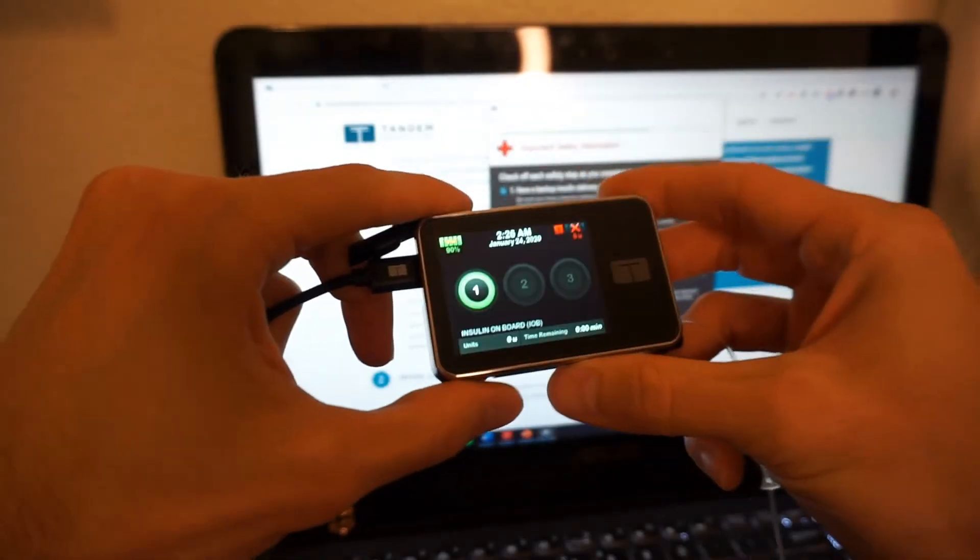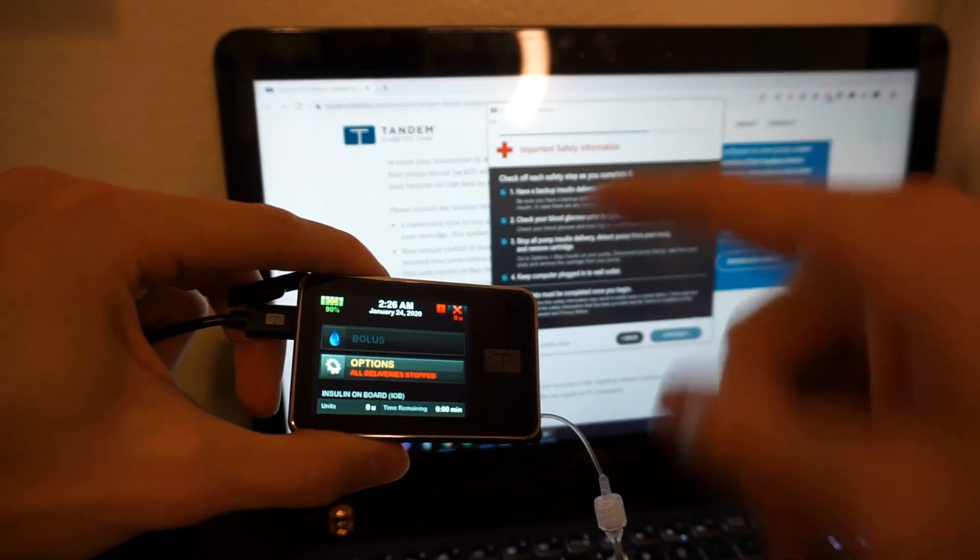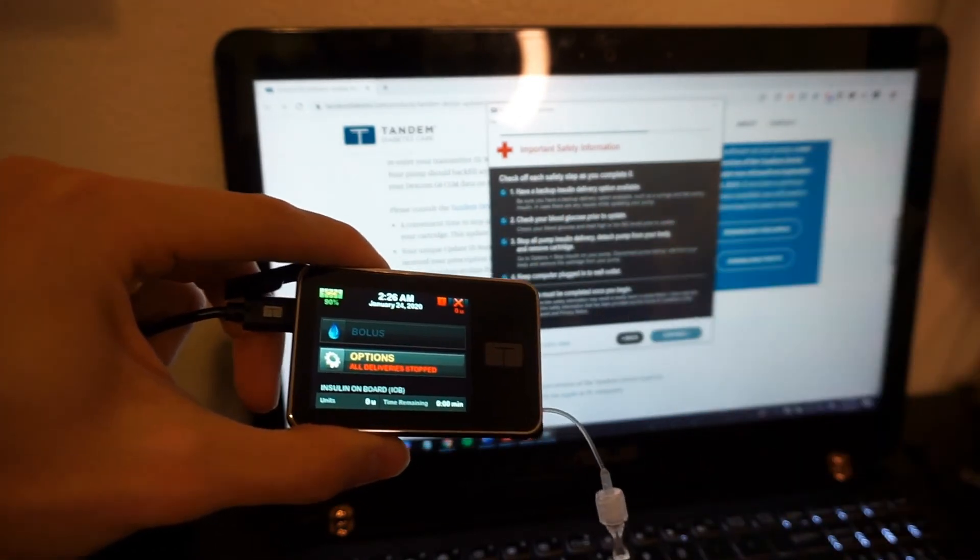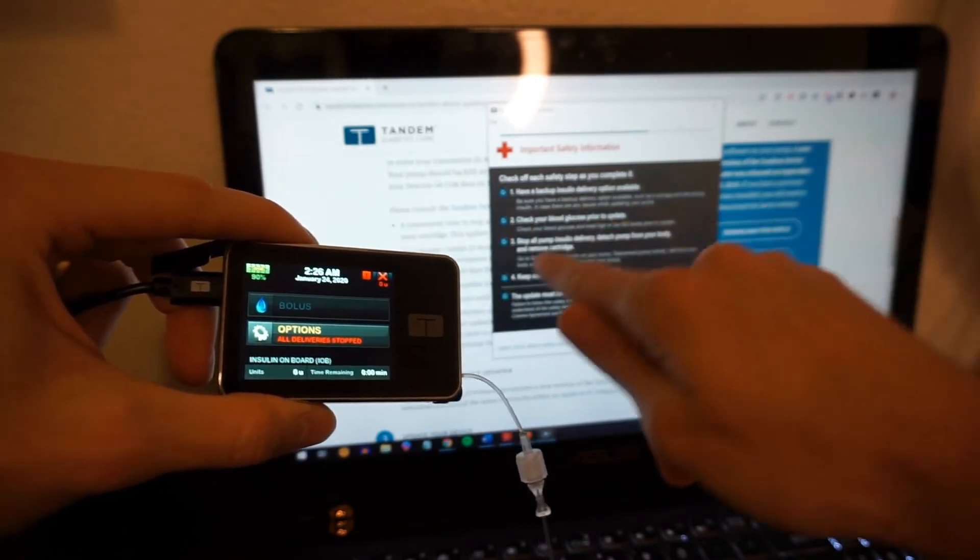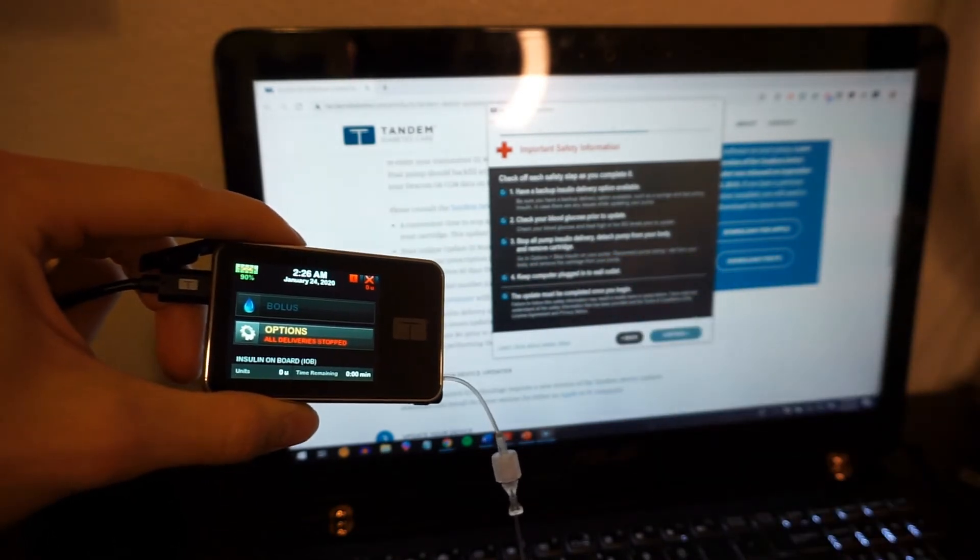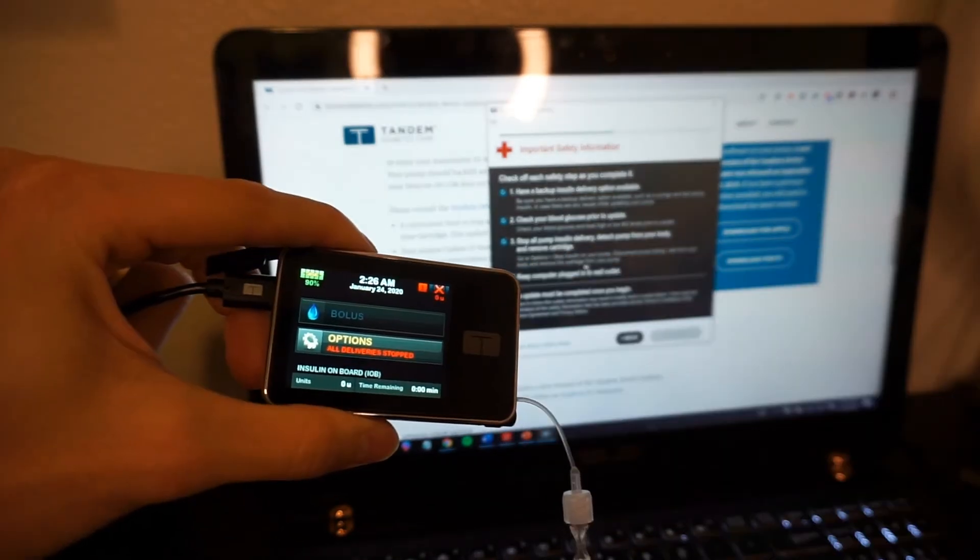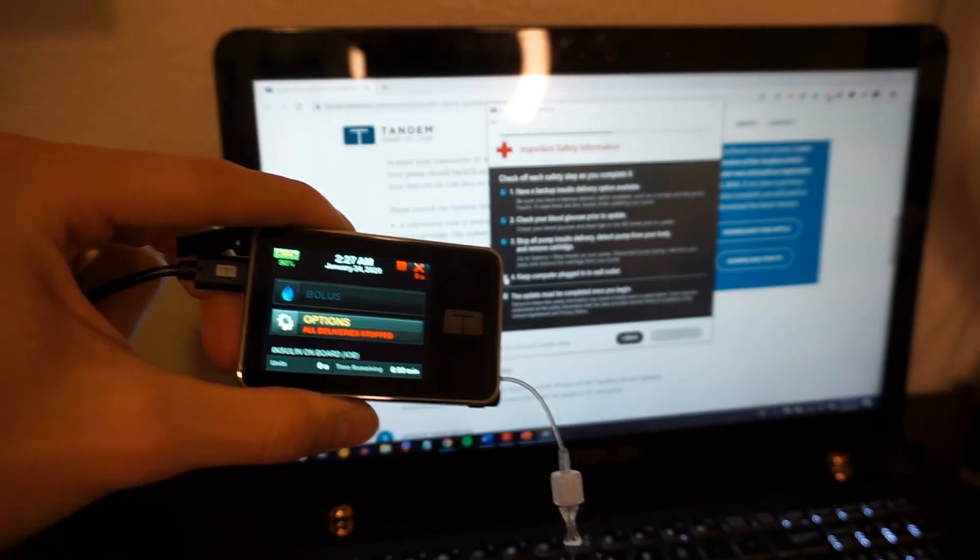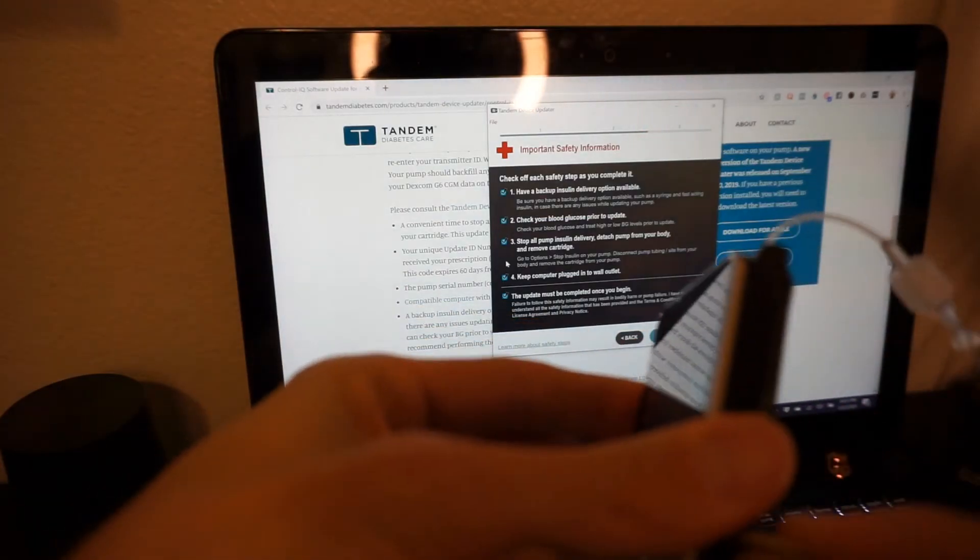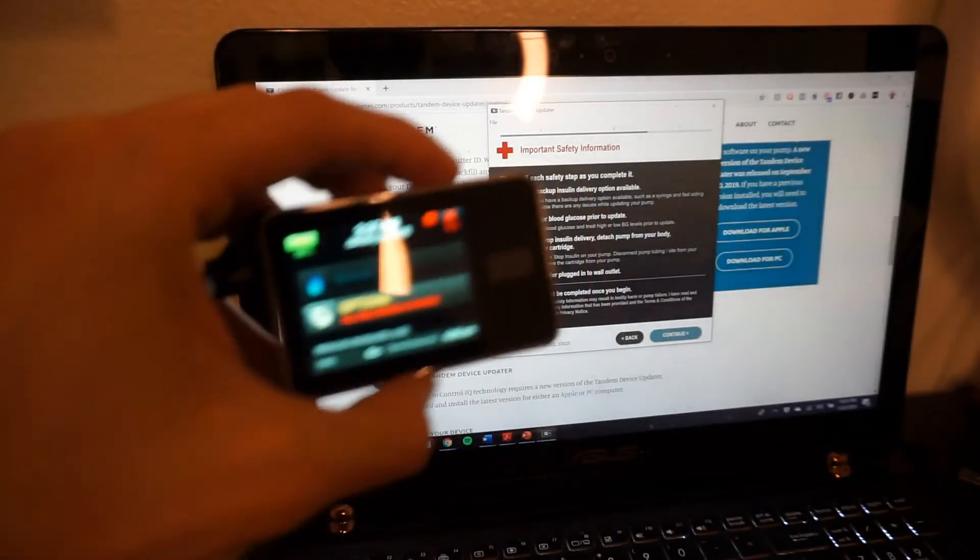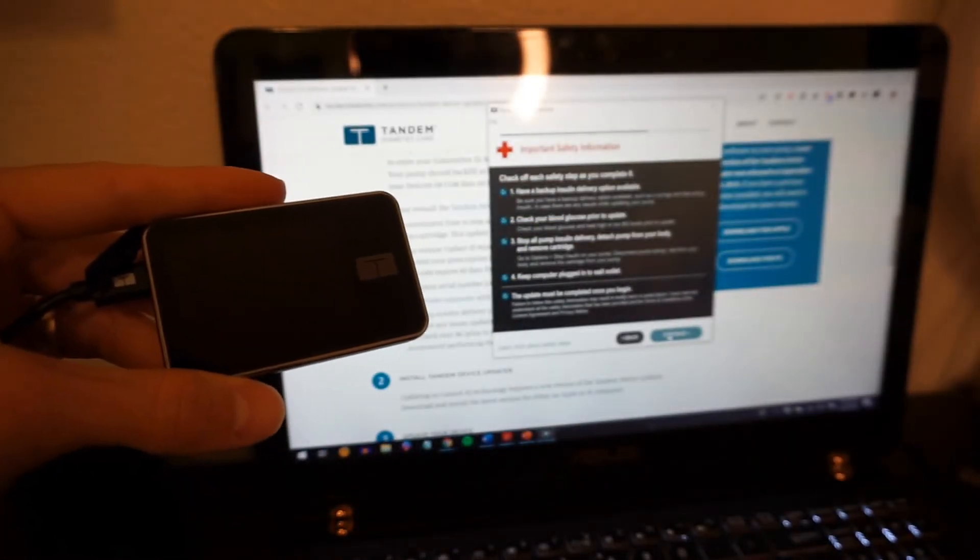All right, guys, so here's the deal. I just hit continue after I matched up my pump serial numbers. Don't know if it's special, so I didn't show it, but what you're going to do is have a backup insulin delivery option available. Check your blood glucose prior to update. Stop all pump insulin delivery. Detach your body and remove cartridge. Oh, and remove cartridge from your pump. I didn't do that, so I'm going to do that real quick, and then we'll come back. All right, guys, so we're going to remove the cartridge. There we go. Now that I've done that, we can go ahead and continue.